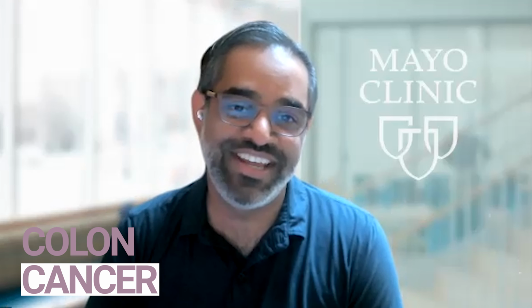I've always been interested in digital pathology, and I have used it mainly in a research setting, viewing slides, working with other groups, just basically reading slides digitally, not really doing much image analysis until I would say 2 years ago when I thought about this project of using image analysis for colon cancer and some of the newer techniques we have now with neural networks and deep learning and tools that are a little bit easier for a practicing pathologist to use rather than needing a Ph.D. in computational tools.